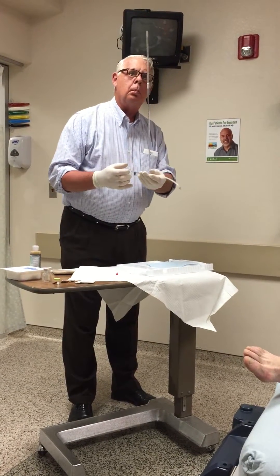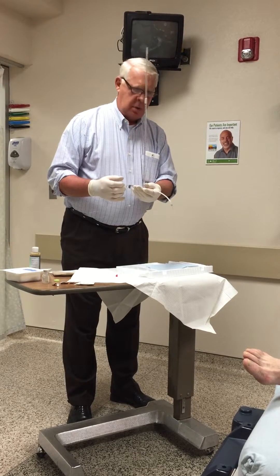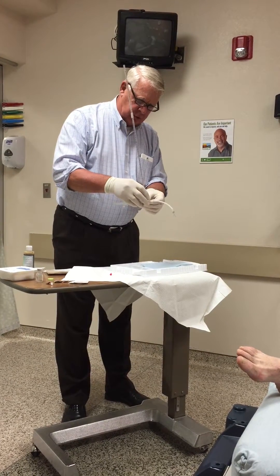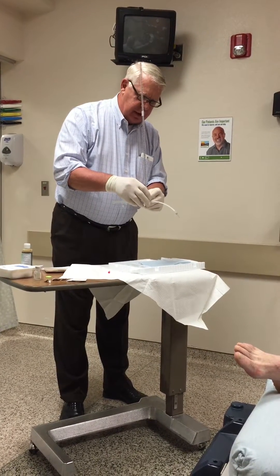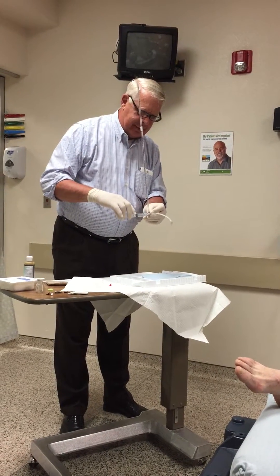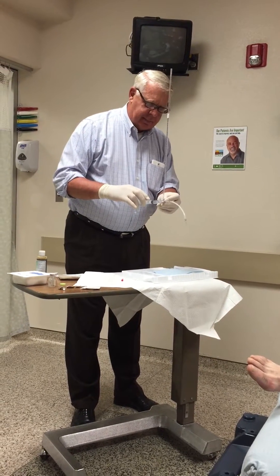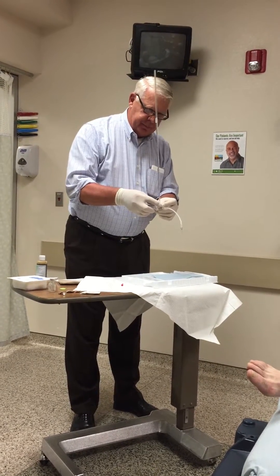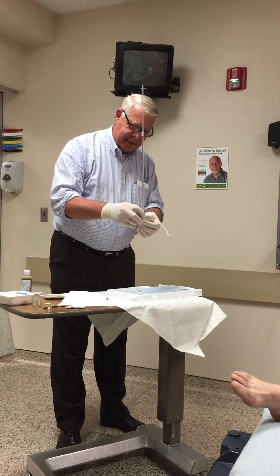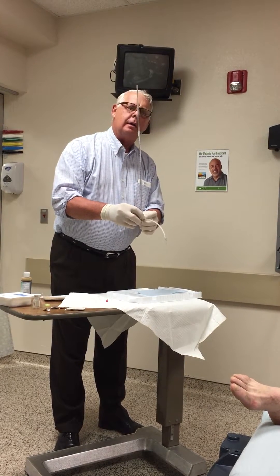So you're filling it now to what level? We fill it right to the top. I think the toughest thing on these is to try and figure out how these three-way stopcock things work, because you want to get rid of all the air correctly. We've got to — so I can see when it's up like this that we've got the straight-through.